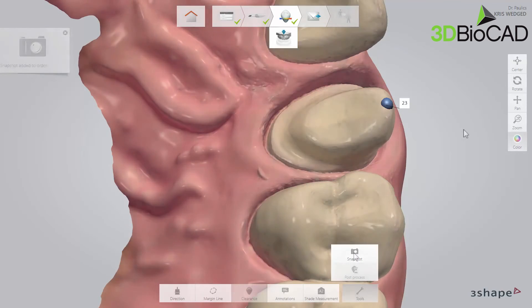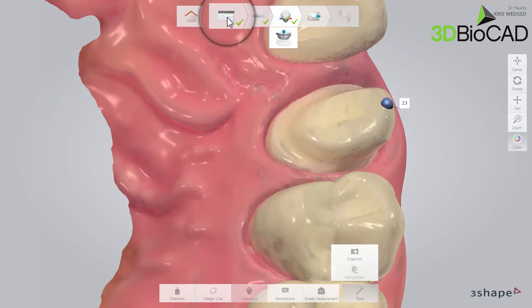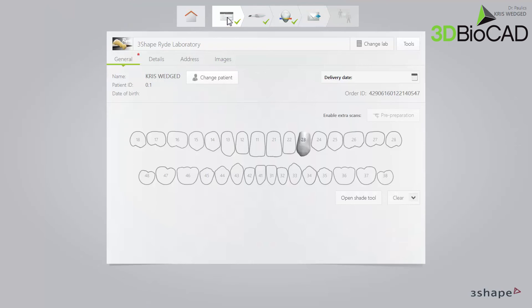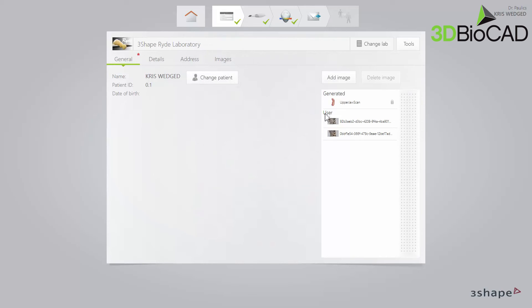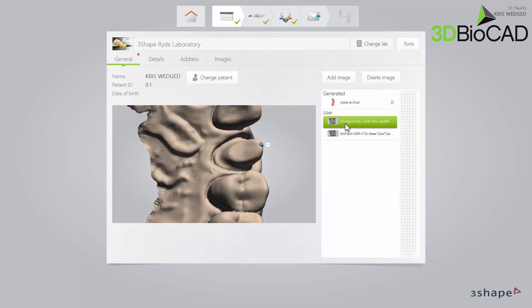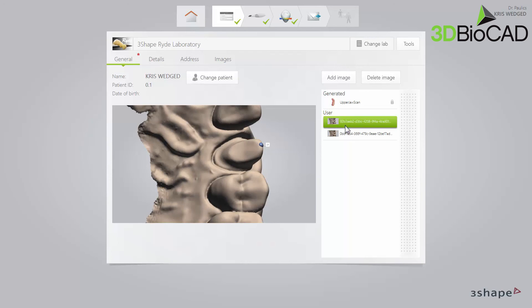Now go to the Order Form window by clicking on the Order Form button in the Workflow bar. Then click on the Images panel and select the Snapshots from the list on the right. Switch between the screenshots to see the effect of the post-processing.